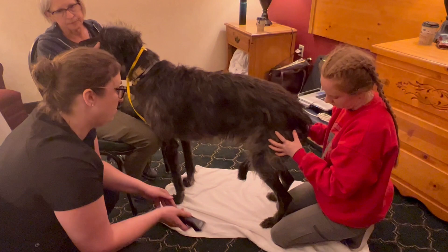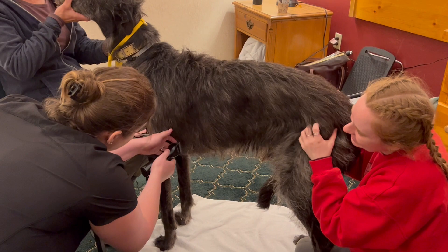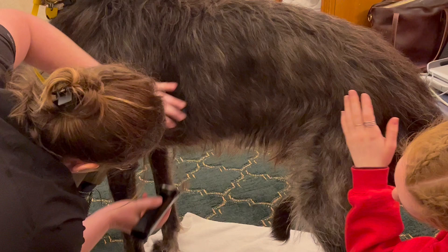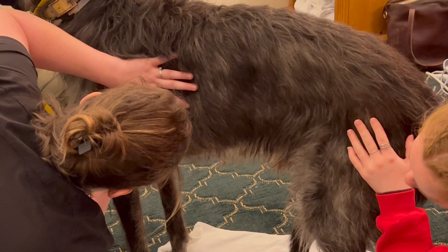That's where we're going to go. It's good to put them far enough behind the elbow so if they go to lay down, their elbows aren't hitting against the patches. So there's one patch. The patches don't need to be in a perfect alignment — they just can't be touching each other.